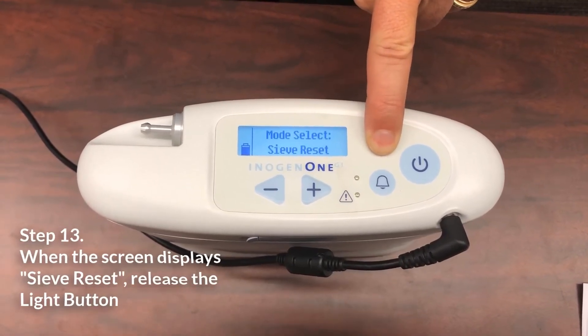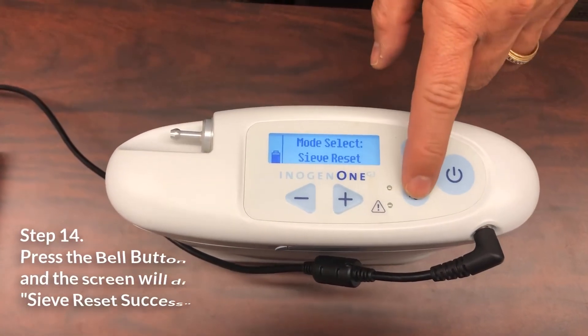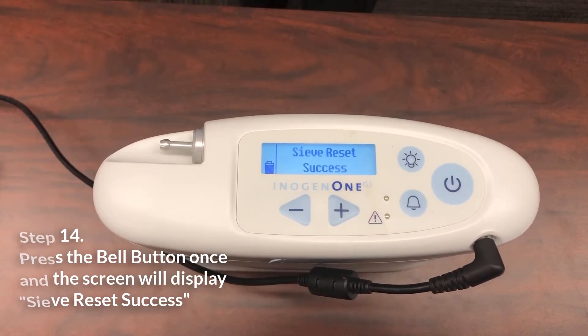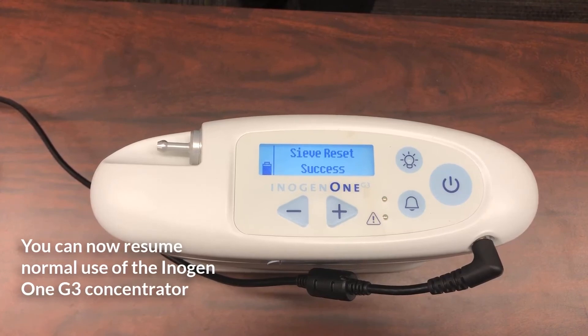The screen will display sieve reset. Release the button once the message is displayed. Press the bell button once and the screen will display sieve reset successful. You can now resume normal use of the Inogen One Gen3 portable oxygen concentrator.